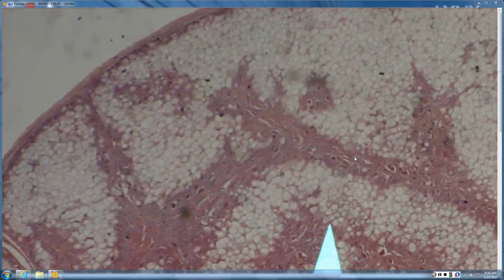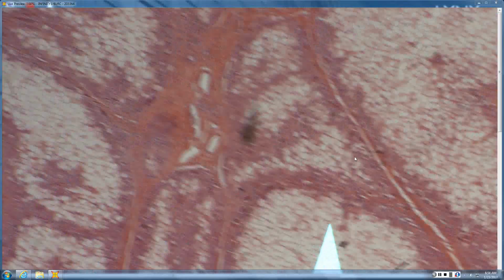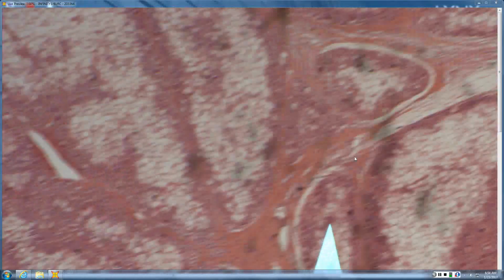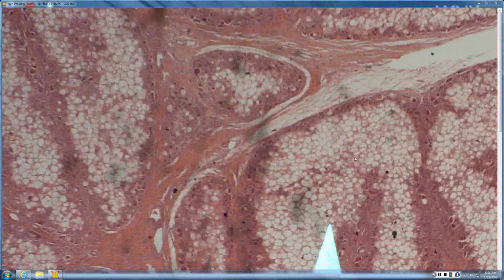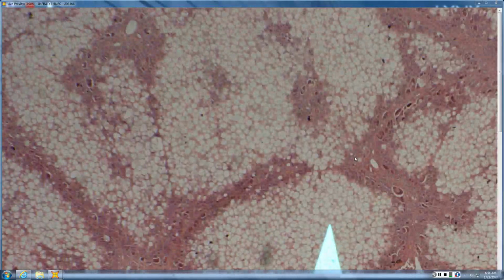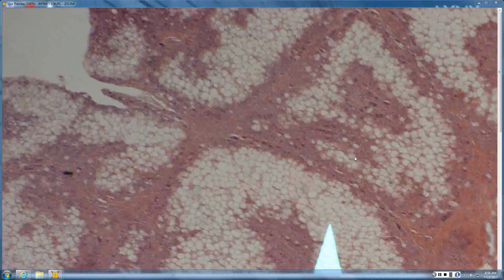Alright, so I'm not sure why such a large biopsy is taken for this entity. But at scan you can see that there's kind of a granulomatous infiltrate surrounding the fat. And I think a clue here is that this doesn't look like adult fat, it looks like baby fat because the lipocytes are really tiny, which is a helpful clue.